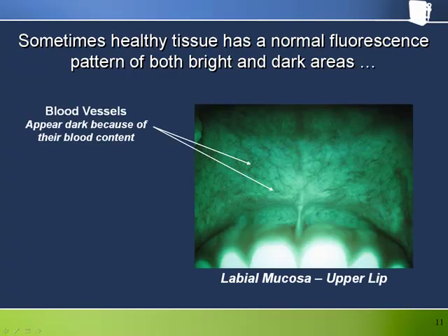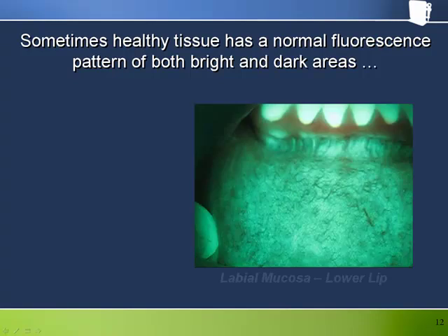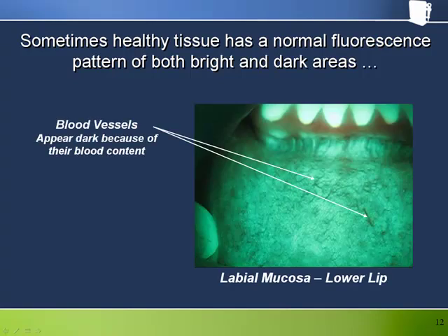This is the labial mucosa on the upper lip, with blood vessels again showing up dark under the scope. The labial mucosa on the lower lip presents similarly to the upper lip.